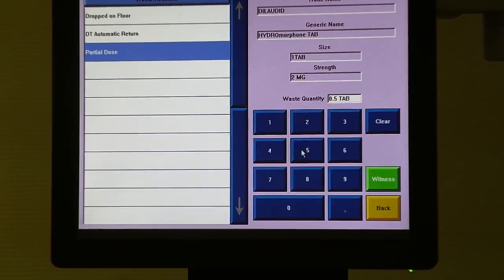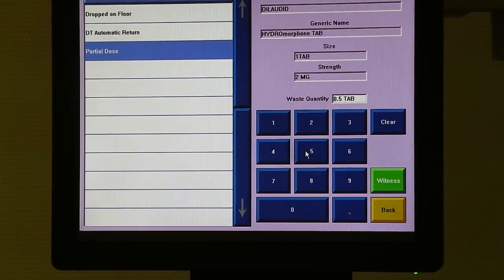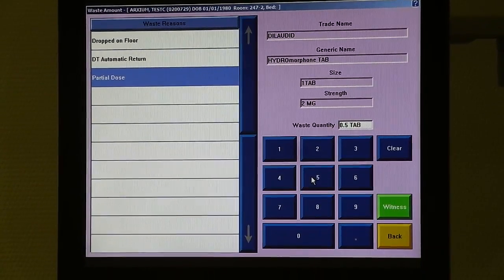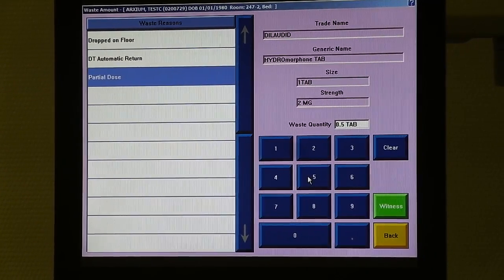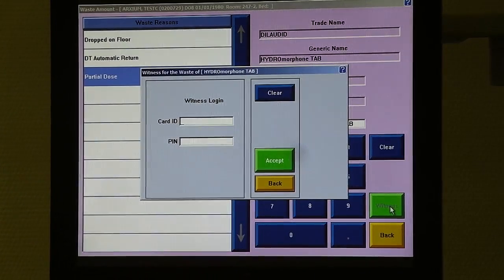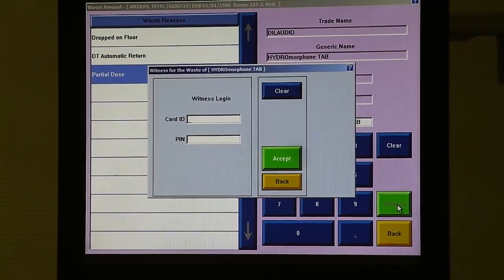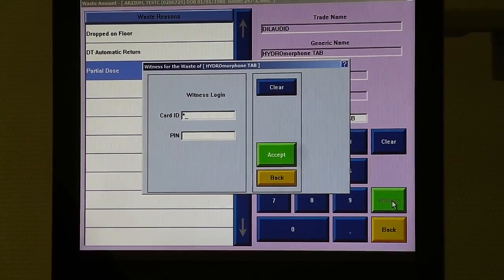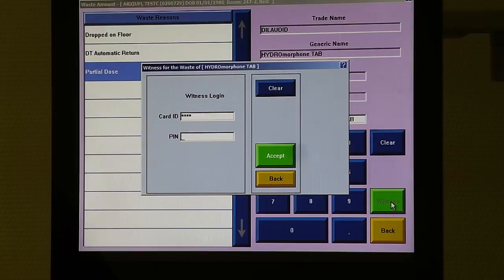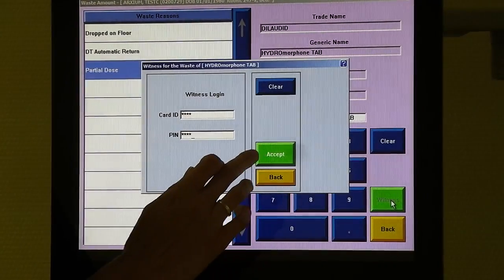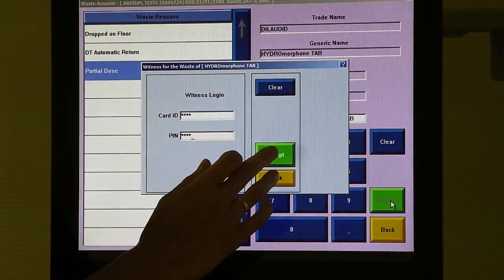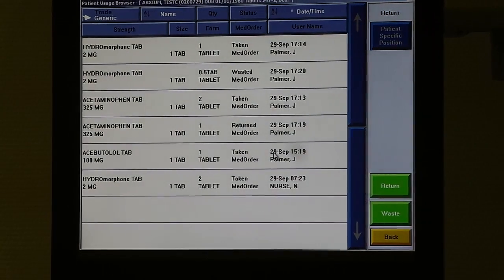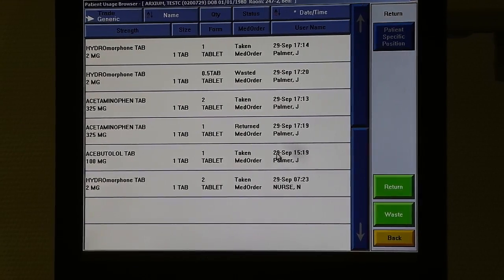So narcotics and controlled substances are prompted to have a second person witness your waste. So when I hit this button, it's going to ask for a second person to log in. Make sure you have a buddy at the station to complete this process. They will enter their information and hit accept. You've now wasted your medication.